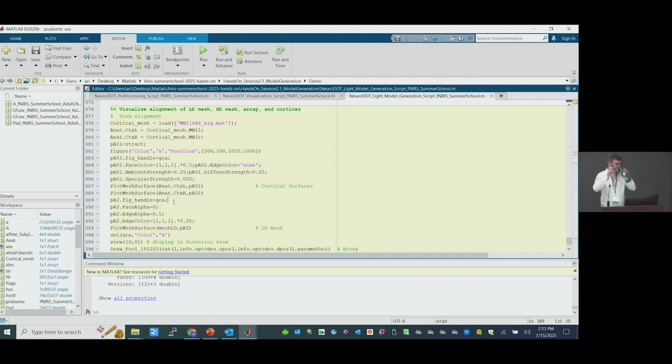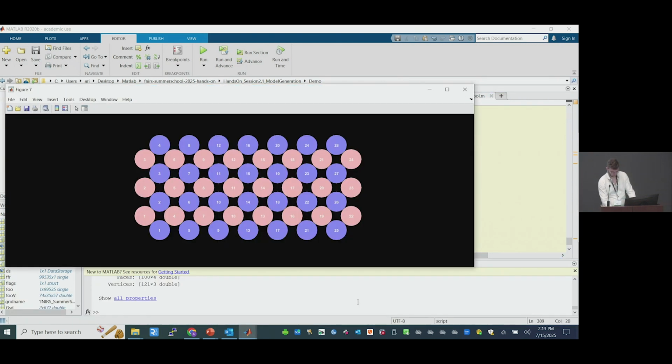So first, there's almost identical numbers of sources and detectors, right? They're sort of subtle, like maybe 24 versus 28 or something like that. What we do is we actually usually don't completely fill the detector channels because we want one of the detector channels to be the sync signal. So that's why we would drop down on that. But otherwise, we're trying to make it as symmetric as possible. That's what, 28 versus 24? Yeah, so we keep things as symmetric as possible.